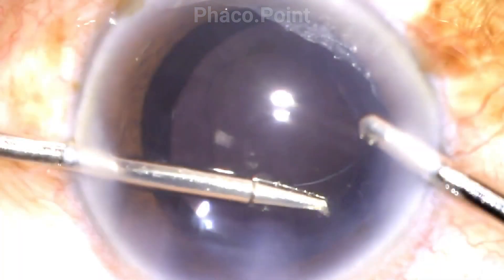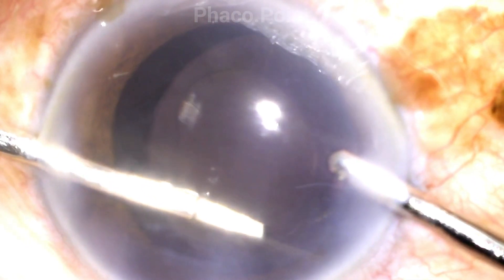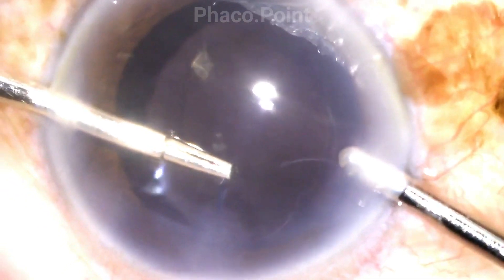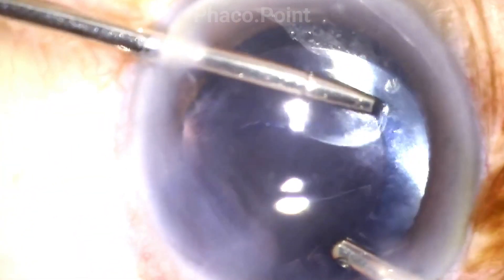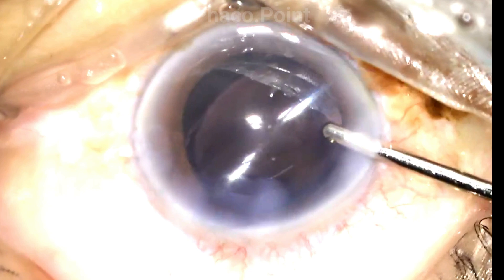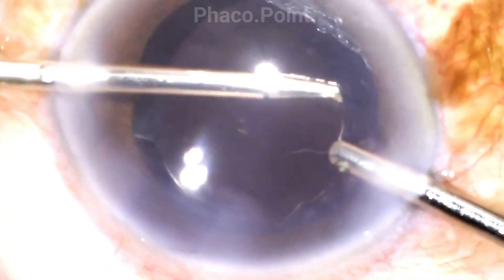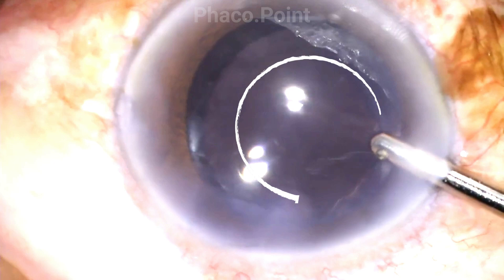Therefore, I prefer to make an oblique tear into the anterior capsule so that when I pick up this torn edge, I can control the sizing of my rexis to give me something just as large as I desire. Here I have reached the proposed point where I want to initiate the tear. I am holding it firmly with the capsulorexis forceps and initiating the tear by pulling on the capsule. Having initiated the tear, I fold it upon itself and in a manner similar to propagating a rexis, I enlarge the tear to the pre-desired size. The other edge of the tear is similarly held with the forceps and the tear enlarged to give a larger rexis. At the end of the enlargement, the rexis is now much larger and of an optimal size.